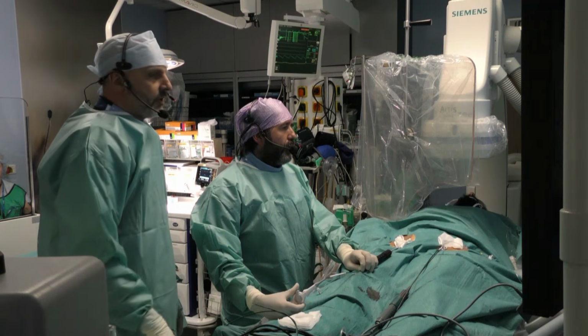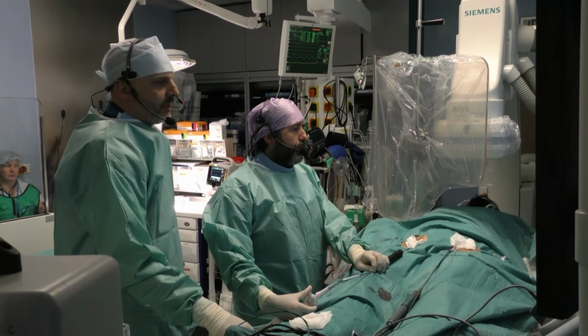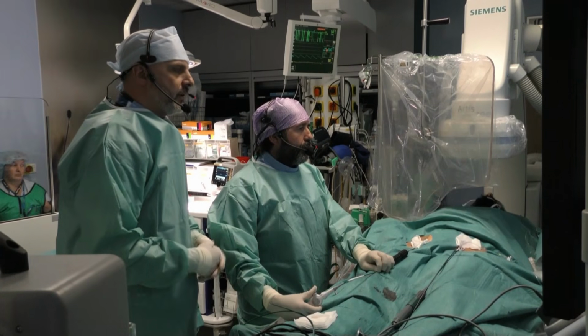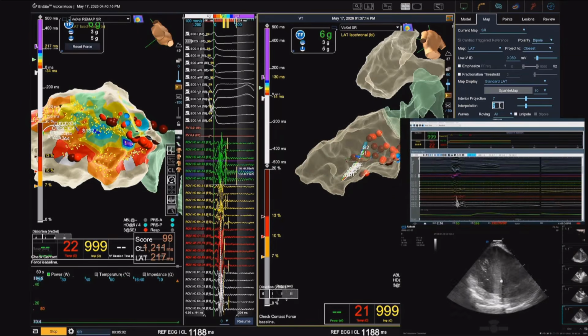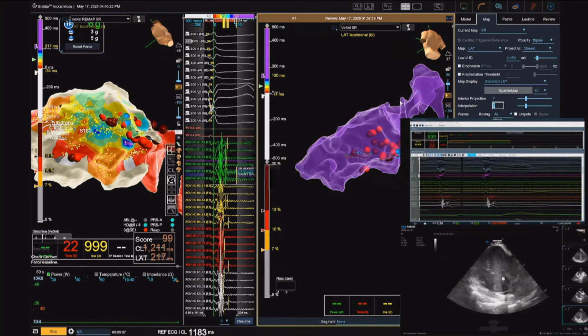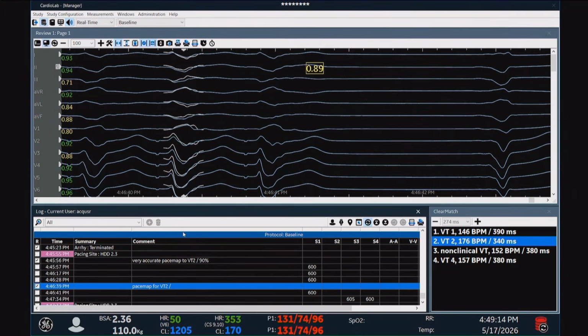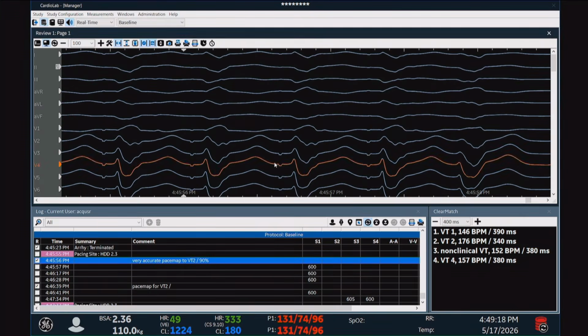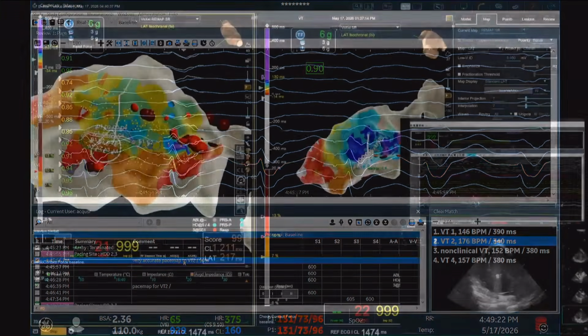We can see you. Okay, so we are live. Welcome back. We spent a lot of time ablating on the lateral mitral or basal mitral isthmus, and we probably got rid of these two morphologies, which were having exits towards the posterior septum, but we are now remapping a more apical region or mid region of the lateral wall. So maybe if you can show the EnSite map. We have HD grid. Can you switch to EnSite?